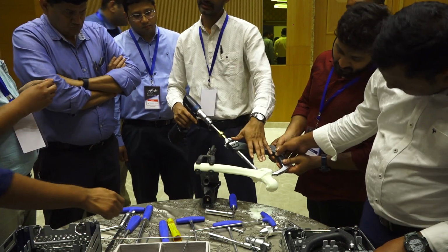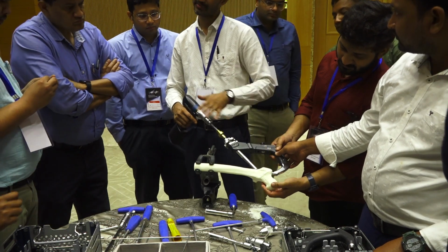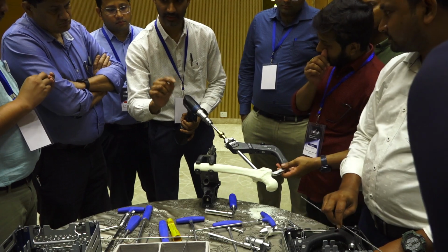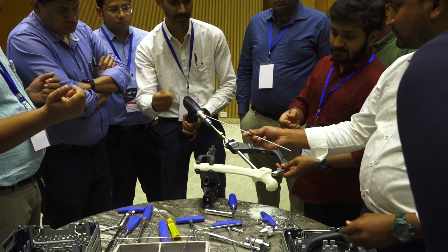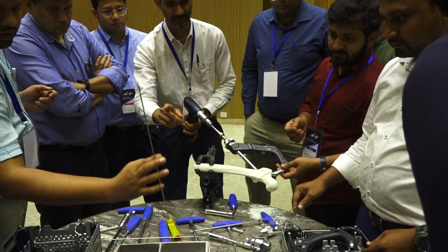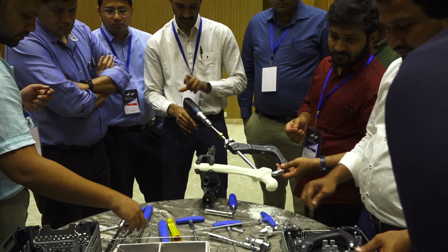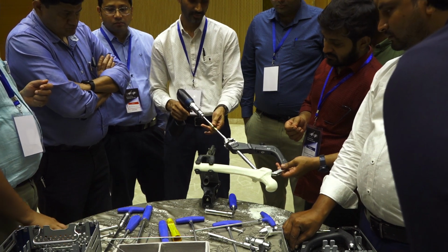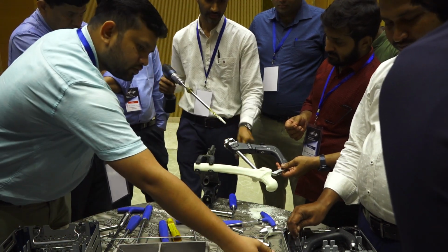While drilling this, most of the time the guide pin sometimes gets out. Solid. So a handle type of thing, push that and then withdraw it so that the guide pin will not come out. Okay. Solid.